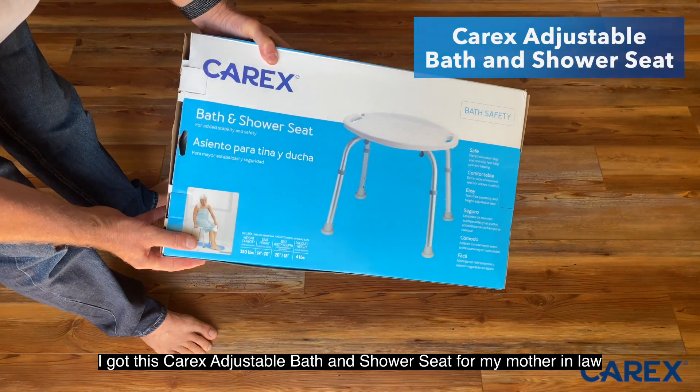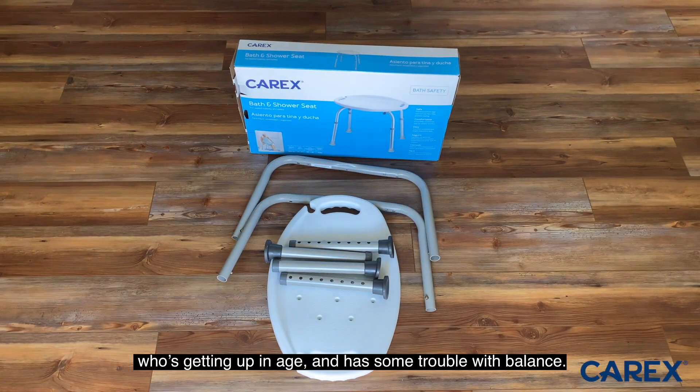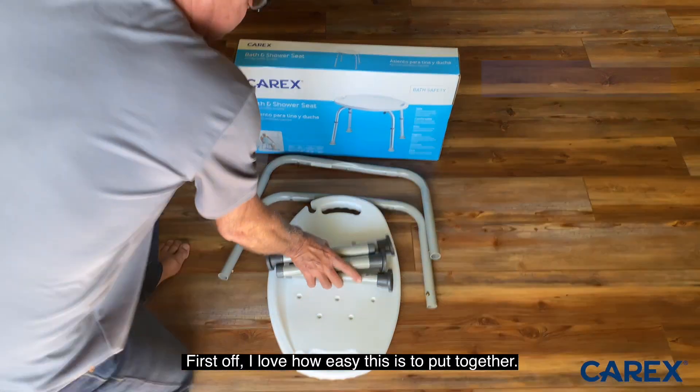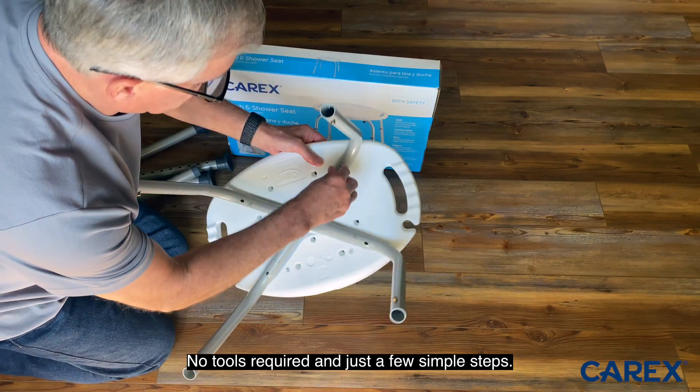I got this Carex adjustable bath and shower seat for my mother-in-law who's getting up in age and has trouble with balance. First off, I love how easy it is to put together — no tools required and just a few simple steps.